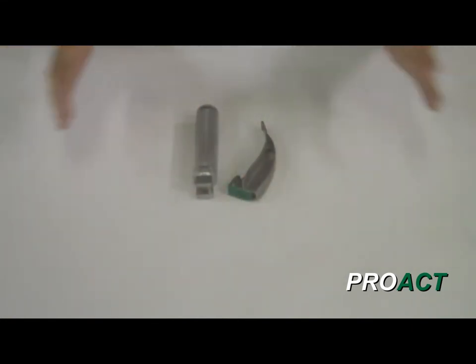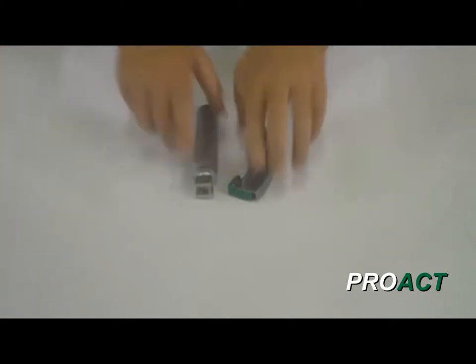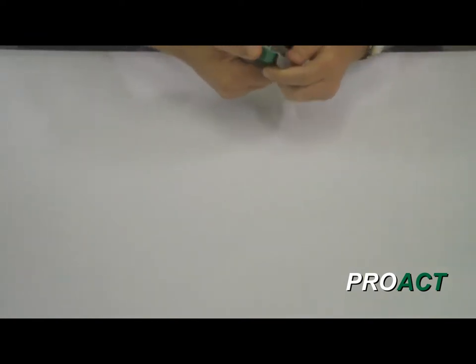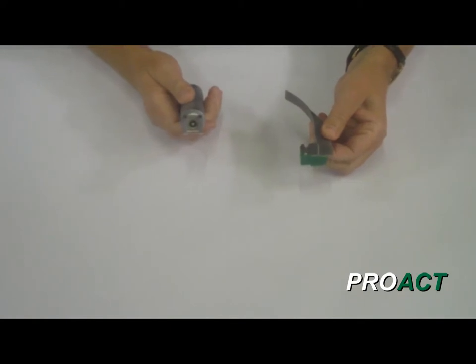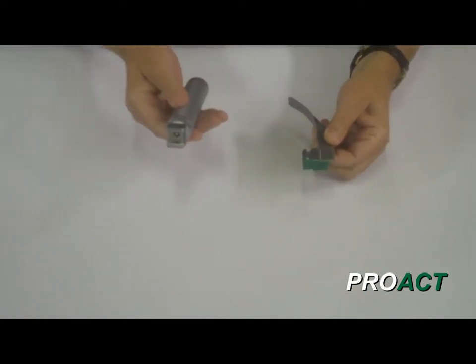If you can imagine, this is your laryngoscope. It's in the bottom of a bag with a lot of other things in there. You need it quickly in an arrest situation. You reach into your bag, you go to put them together, and it doesn't fit. Guess what's happened? You've got a green system blade and a conventional handle. They don't fit together.